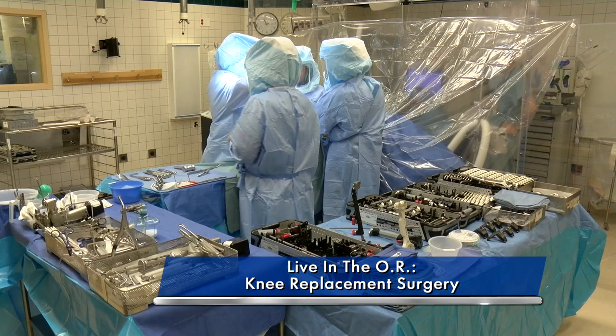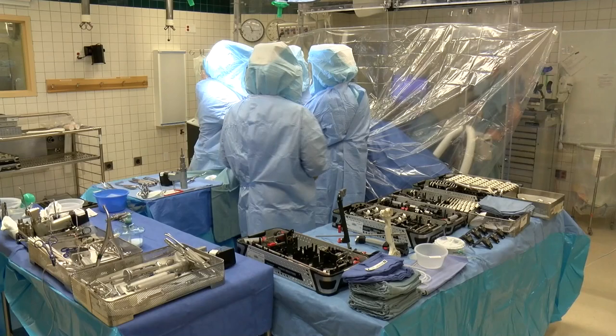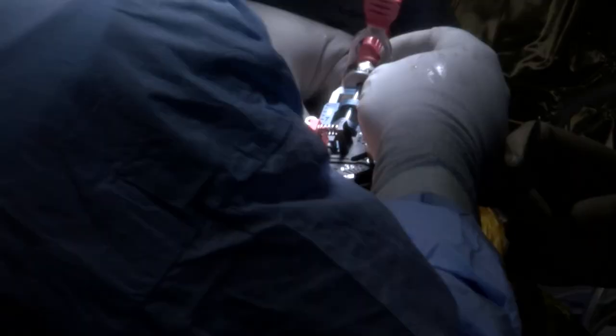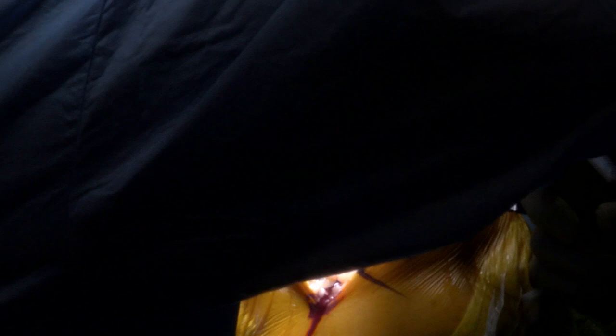Can you tell us a little bit about some of the advancements in terms of precision and accuracy you're able to achieve now versus many years ago? We definitely do it through smaller incisions than previously. The common term everybody throws around is minimally invasive surgery, and everything we do today would be considered minimally invasive compared to what was done 15 years ago. The implant design has definitely improved as our understanding of why knees fail over time has grown. The main reason knee replacements fail over time is the plastic wearing out, and the current generation of plastic we're using looks great. The goal is to get hopefully between 20 to 30 years out of a knee replacement, which is great longevity for the device.